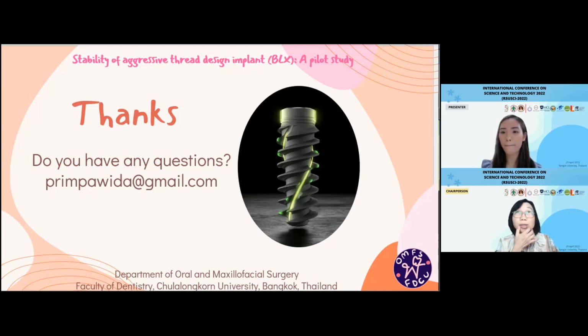How do you control this? Do you have a condition for the surgeon? How experienced do you define in this study? Perhaps experience of placing more than 5 implants? I think more than that, because this implant has a learning curve, as it is a new one. I think maybe 10 implants with this system.